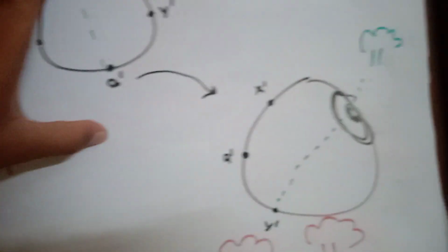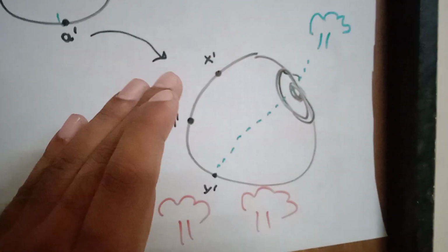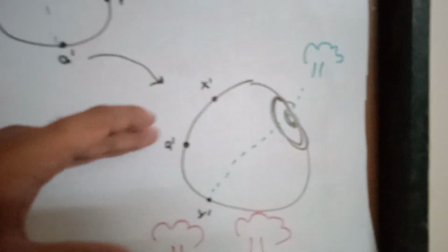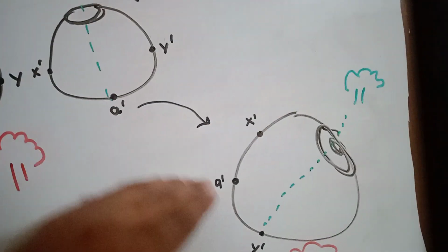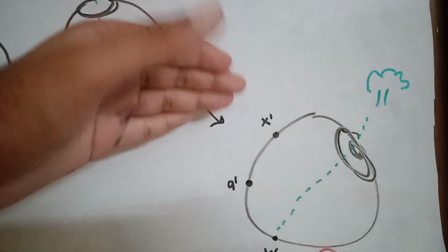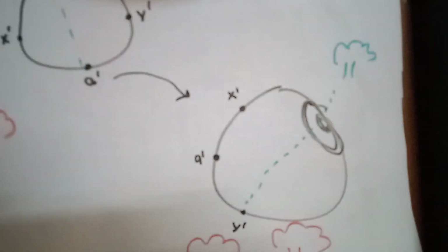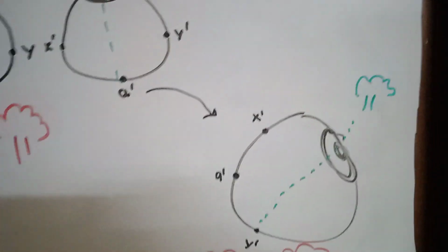Let's rotate it like this. What is this, by the way? Is it esophoria or exophoria? This is exophoria. Very nice. Now you will see the A point, because we have shifted it like this, has moved that way, and to the left of the A is X and to the right of the A is Y. Now the tree is falling on Y. That is a different point from A. So that's why you will see two trees instead of one.